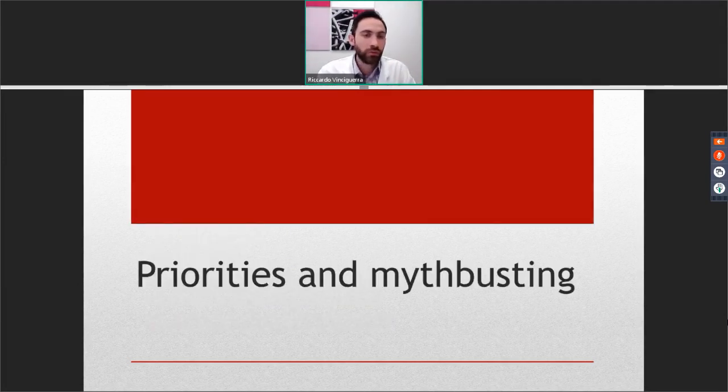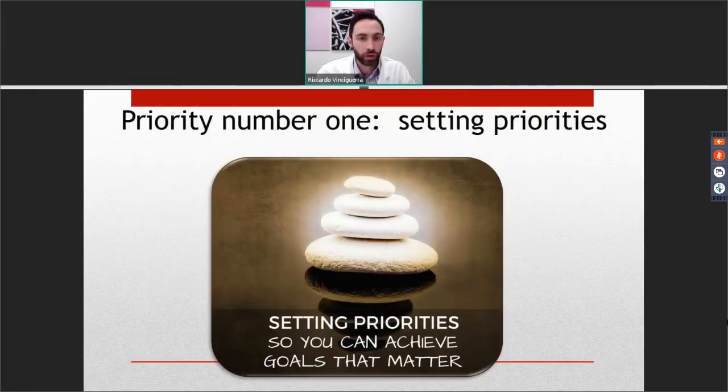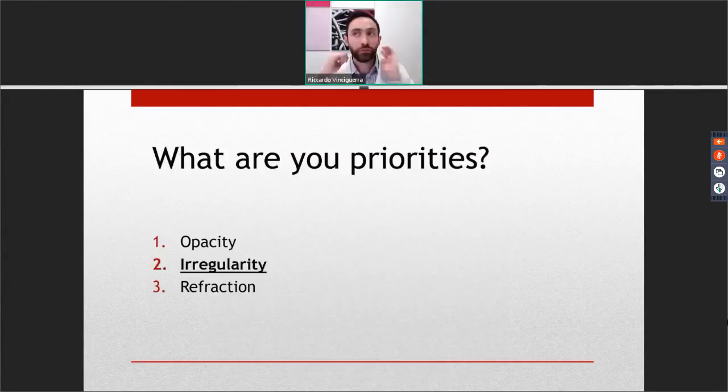But we have to go through some priorities and myth busting. So first one, you need to set your priorities. I'm very happy that Bruce Allan spoke with you about, for example, minimizing depth and how to reduce the amount of tissue. So the first thing you need to remember before going to the high order aberrations is what is more important between opacity, irregularity, and refraction. Most of the time, people think that opacity is the first thing you should remove, which is not the case. So this is the first take-home message.